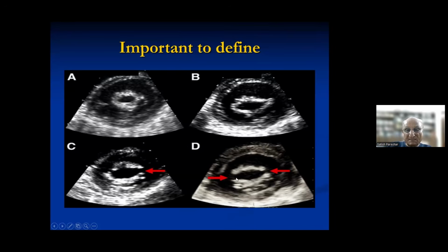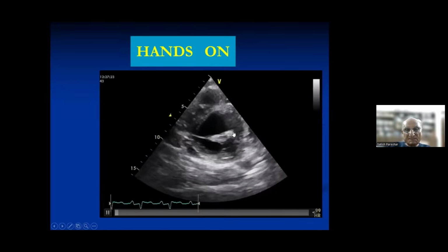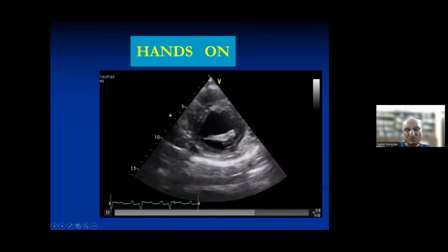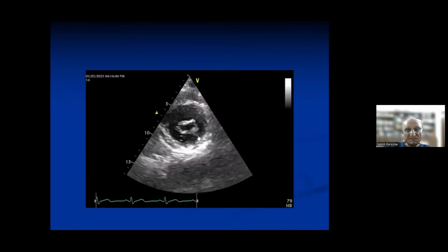This indicates that either the patient has not undergone valvotomy and it is the rheumatic one, or the patient has undergone valvotomy and now they cannot do anything further because you have already split the commissures. Here one commissure is split. Here again, you see possibly they are still fused together. So these two are good for a balloon valvotomy, while this tells us that a balloon valvotomy has already been done, and in this both of them have been done. So, for example, you see mostly this lateral one. This will be shown to you in hands-on. Again, you can see both this and this.